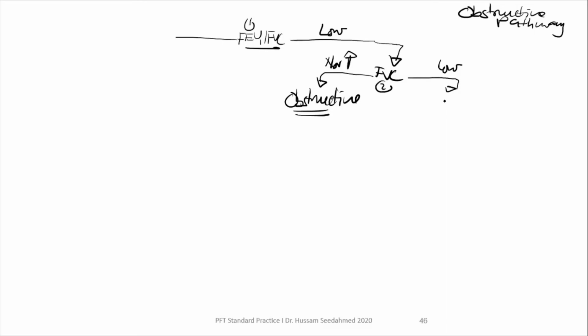هنا step number 3 I will look at the TLC اللي هو ده اللي هيحدد لي في restriction ولا لا. So هنا عندي 3 خيارات either انه يكون low. So if the TLC is low الان عندي الريشيو low والFVC low والTLC لو طلع low ده طوالي هيبقى لي mixed. This is going to be mixed. So I hope you are with me in this.